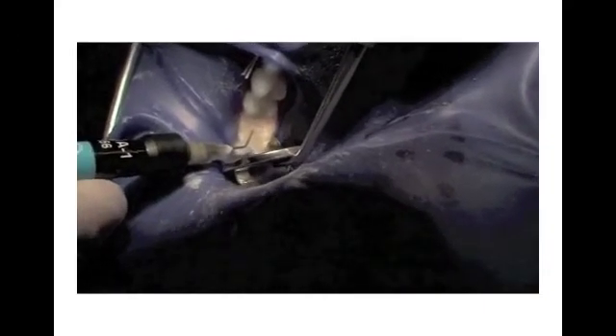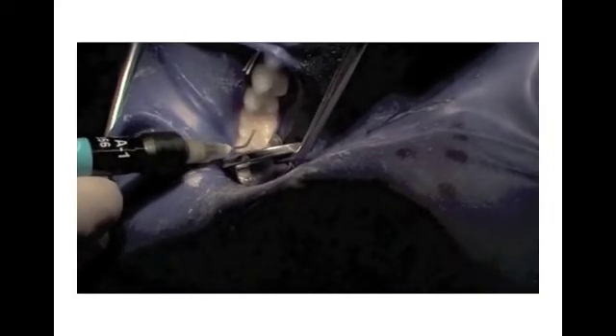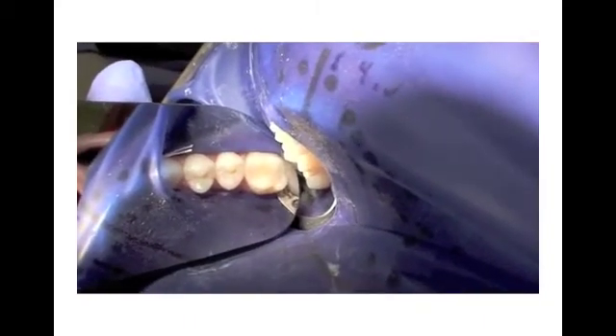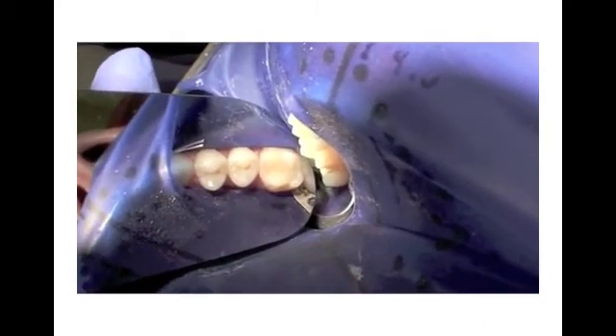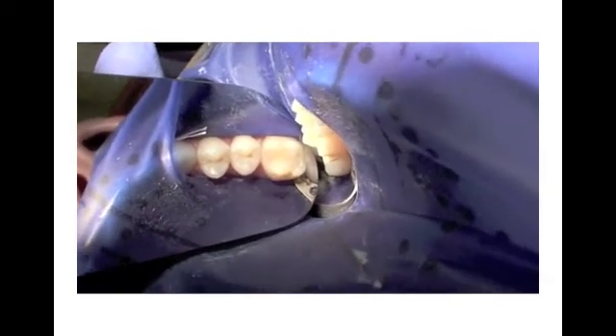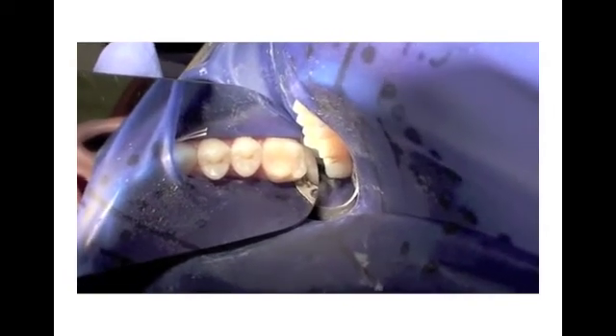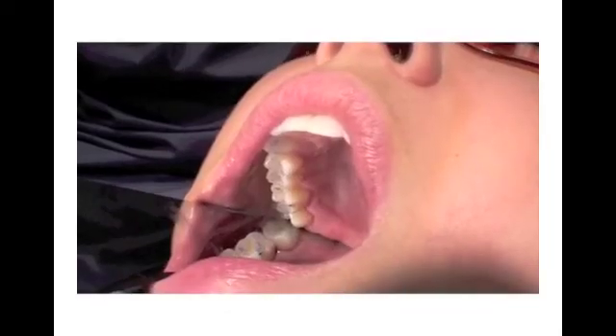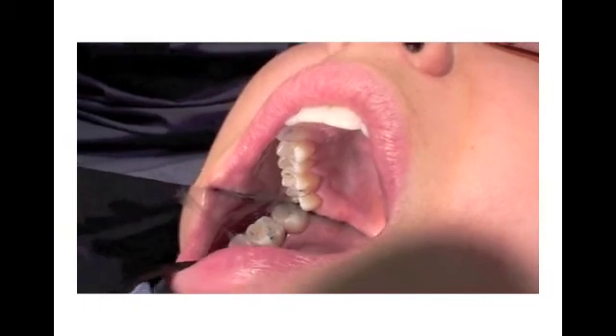The aluminum oxide particles burnish and seal off the dentinal tubules as the decay is removed. By using air abrasion, you prevent micro-fractures of the enamel and at the same time improve retention of your resin composite. Once completely cured with the curing light, you are now ready to check the occlusion. Utilizing the PrepStart H2O yields small cavity preps and restorations that require minimal or no adjustments. They are durable, they are aesthetic, and they blend into the remaining tooth color.